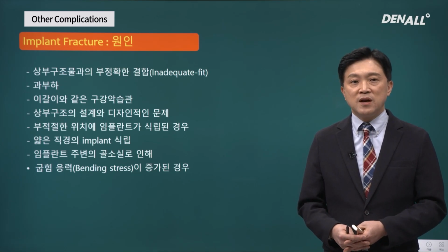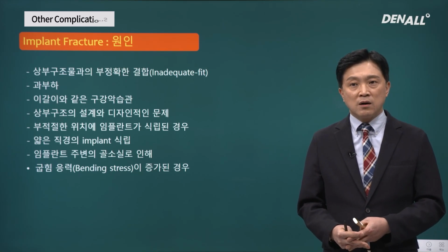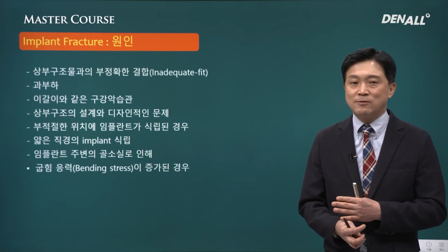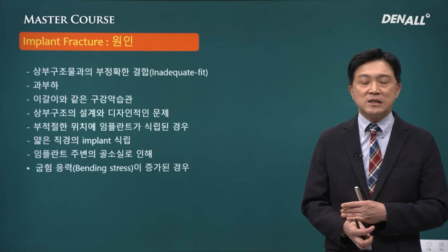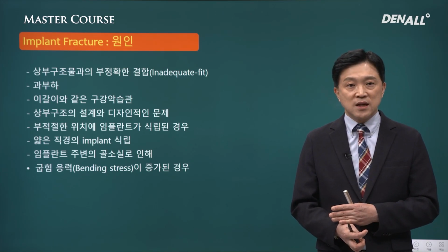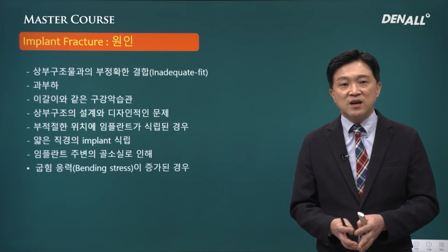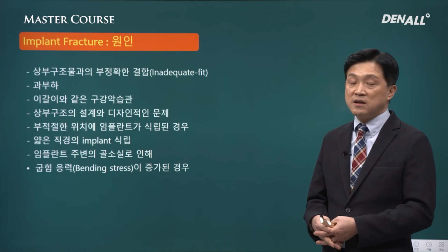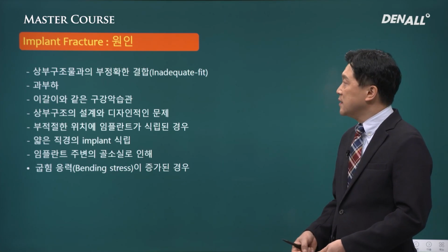Also, when internal submerged implant is placed due to adjacent bone loss, so when there is crestal bone loss, the implant strength goes down significantly. Hence, this can lead to implant fracture. When stress is increased, also implant fractures can occur.